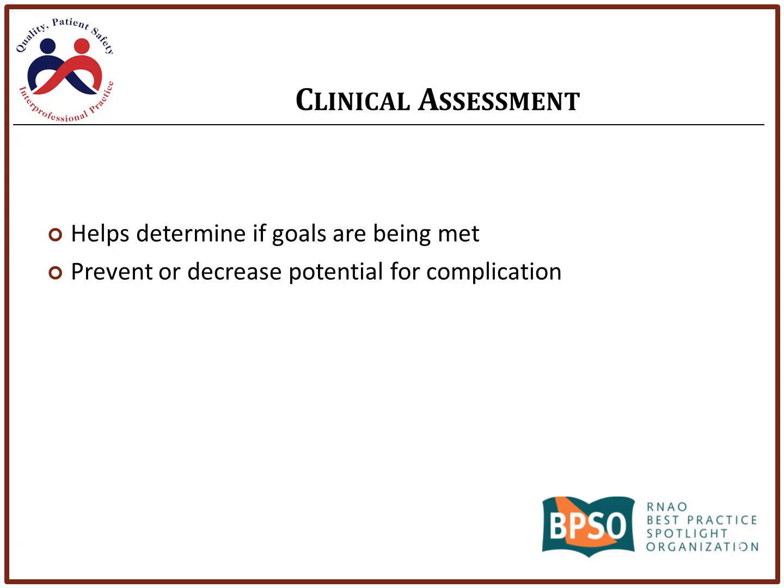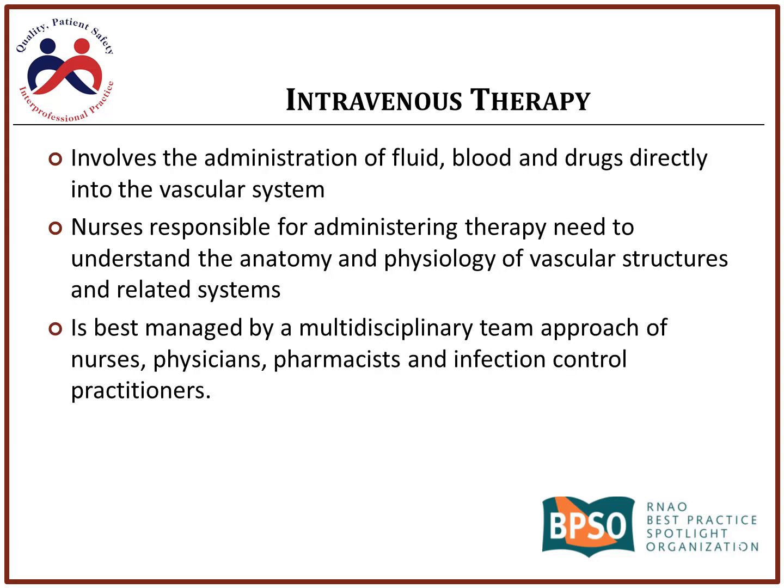Overall, what we're trying to do is when we're initiating an IV, we're doing a lot of assessment. We want to minimize the chance for complications. There's an old saying in carpentry, measure twice, cut once. That's exactly what we're going to do. We're going to spend more time getting prepared for this than we are probably on the actual skill itself. So there's a list here of reasons why someone might get intravenous therapy.